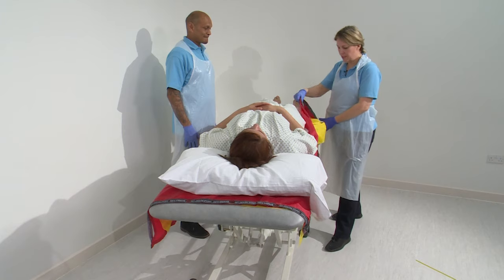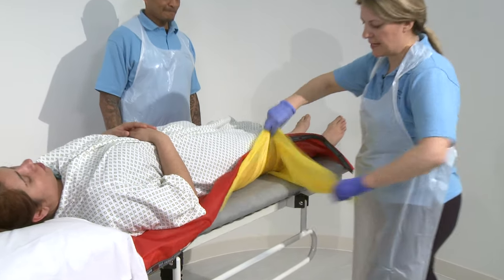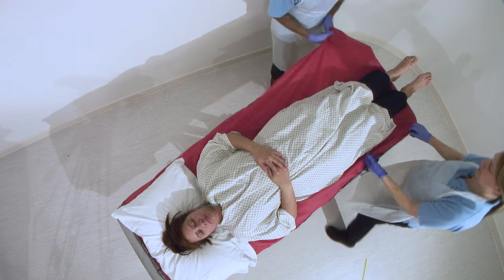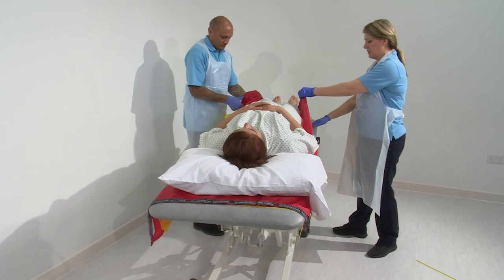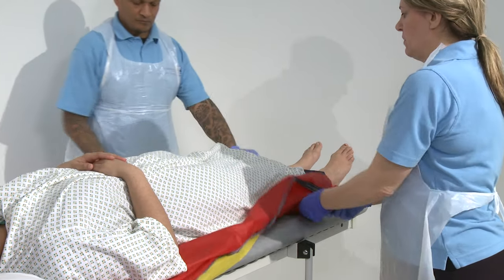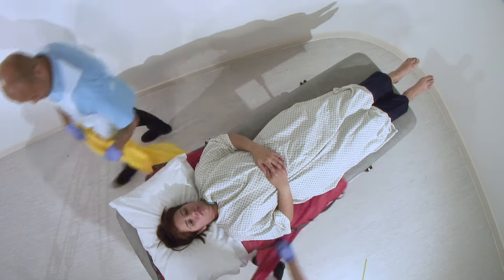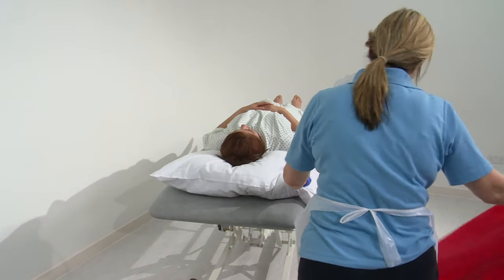So we can butterfly the slide sheets out. What I need to do is just slide this one back through, under on itself, place it underneath the back of the knees towards Rob. Rob will take that side and then he'll pass me his side. It comes back through underneath the knees and I can then get my piece. All we need to do is now walk down the bed — off you go and I'll follow you. And as long as we pull down and away, the slide sheet will come out without moving our patient.